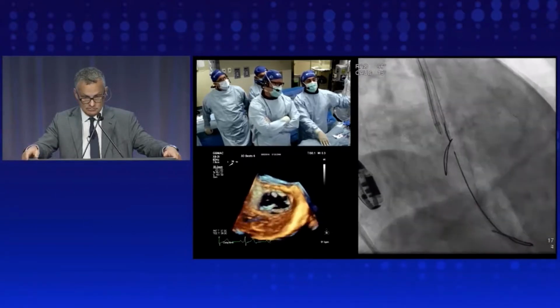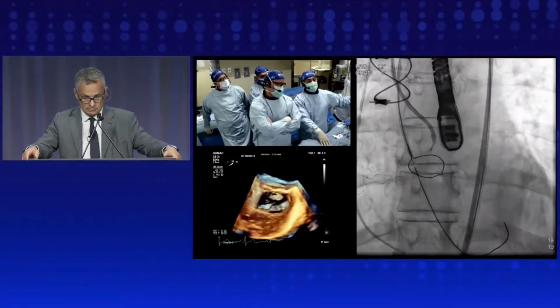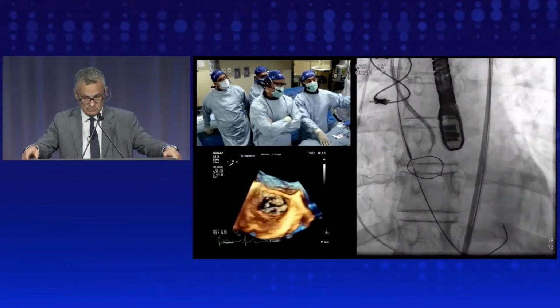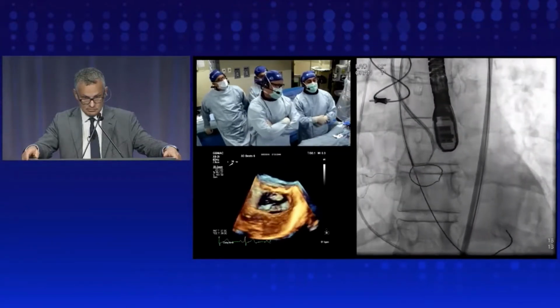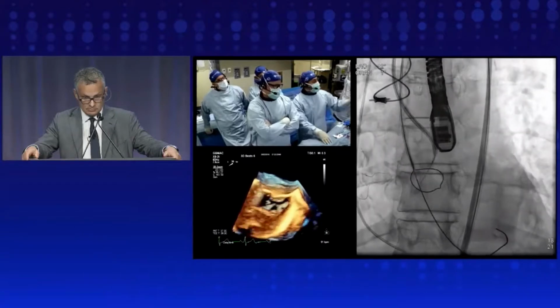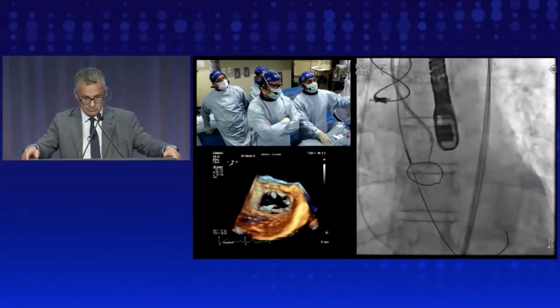So this is the front view. We are more or less in the middle part of the cusp. That's the side view, in which we did it just before being live. We crossed the left cusp leaflet. We snared that.